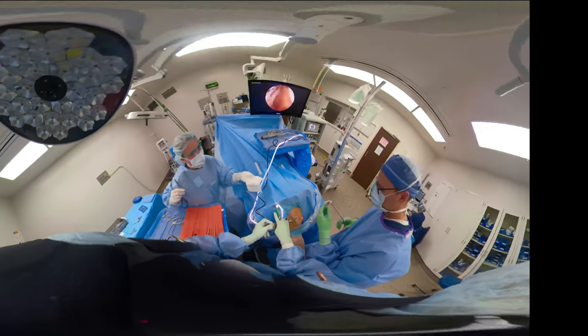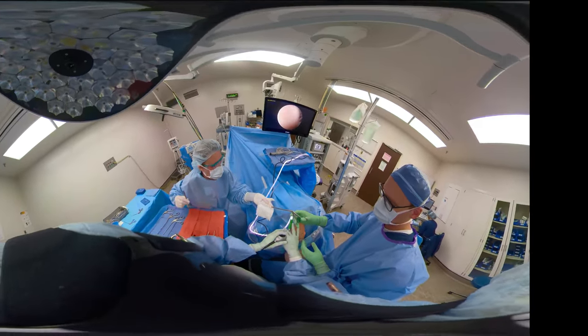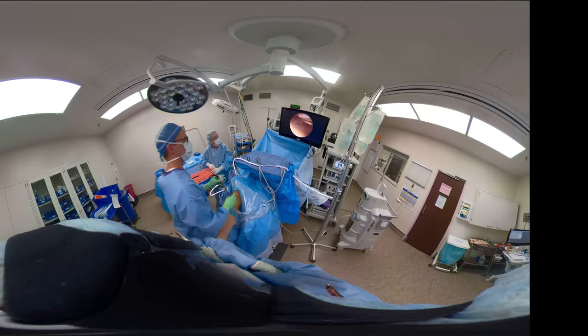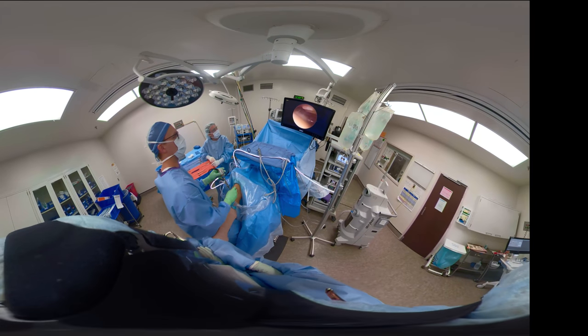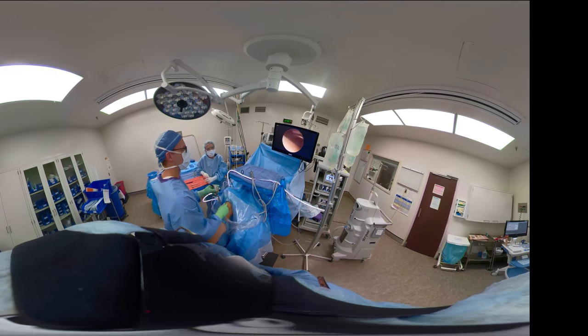You can see how he's rotating it, and now he got the rest of the loose body out. So took it out in 2 pieces. And the key there is to make sure you have a good grasp and make a big enough incision in the portal so that you can get it out.